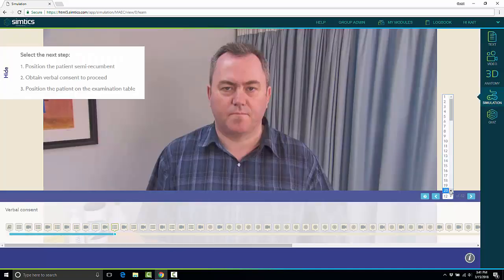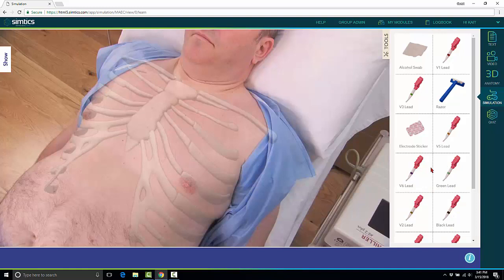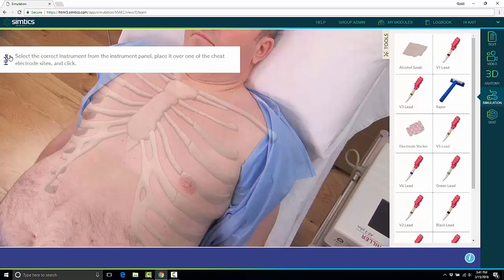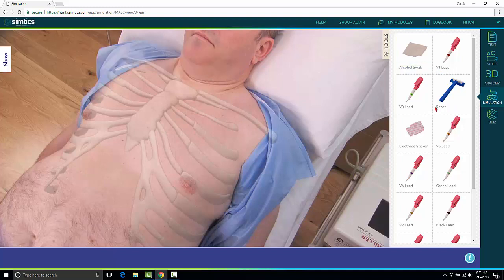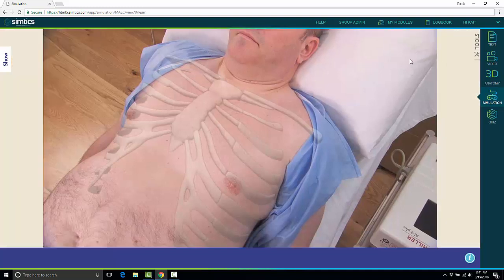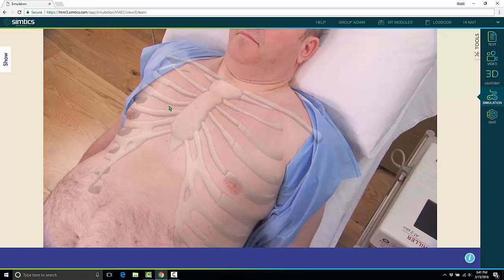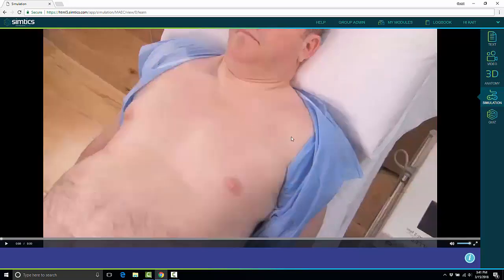I'm going to skip ahead to when the EKG procedure actually begins. They'll have their step of the procedure over here. Again, because I'm in learn mode, my mouse will actually turn green once I'm scrolled over the correct instrument. Same thing when I go to place that on the body - my mouse will turn green right when I'm over the correct area.